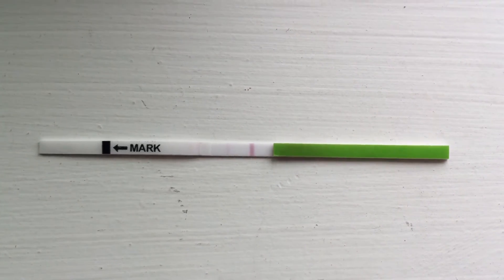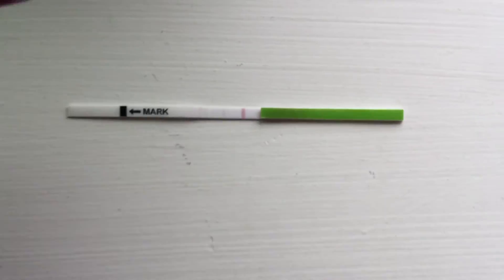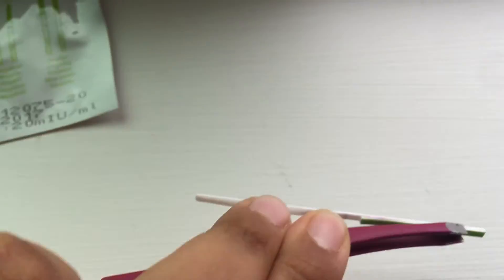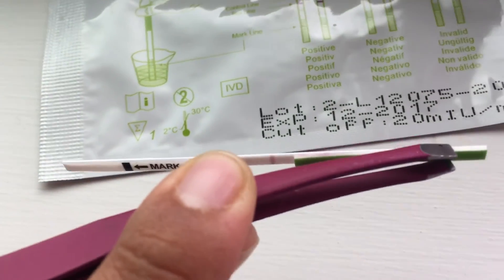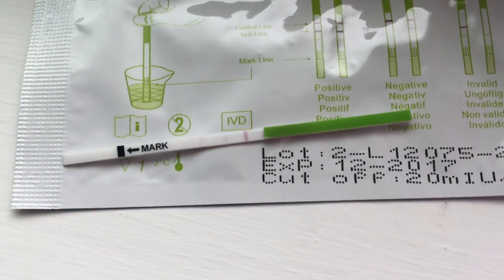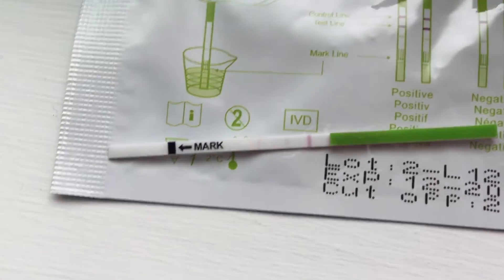Anyways, I just want to show you — these are the little strips. They are tiny, guys. They are just like these itty-bitty little tiny things. They're tiny and skinny, but they work.